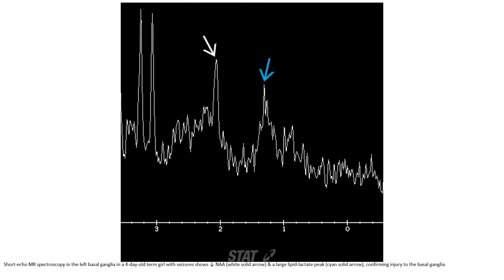Short echo MR spectroscopy in the left basal ganglia in a four-day-old term neonate shows decreased NAA and a large lipid lactate peak, confirming injury to the basal ganglia.